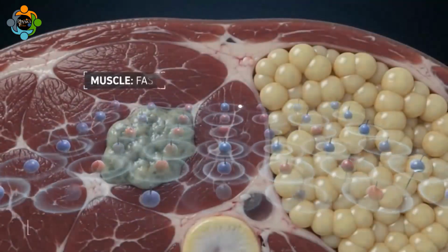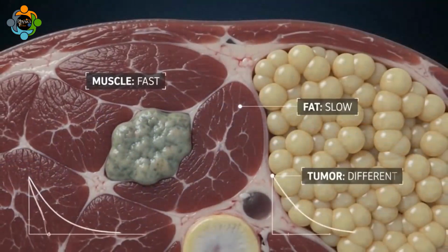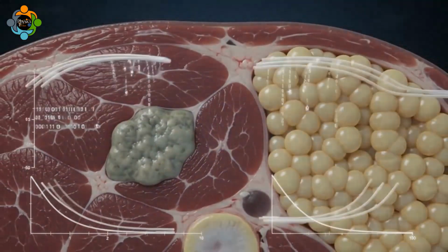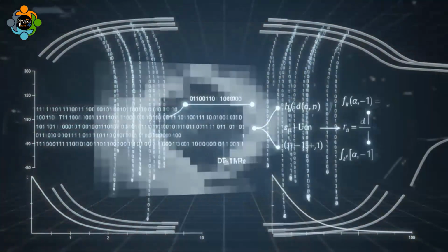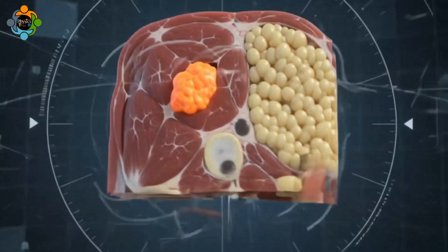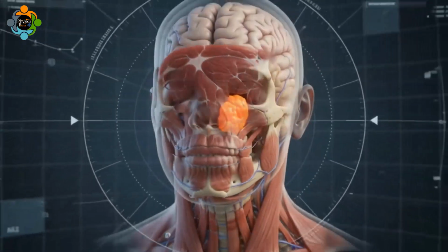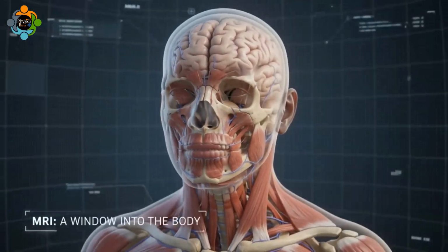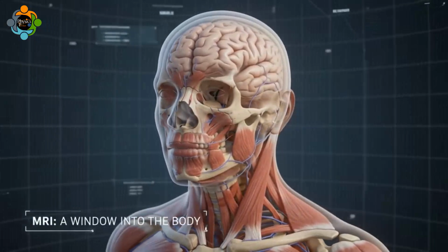The key is that different tissues relax at different rates. Water in muscles relaxes differently than water in fat or a tumor. By mapping these differences, the MRI builds a detailed 3D picture of your body from the inside out, giving doctors a window to see the brain, spinal cord, and muscles with incredible clarity.